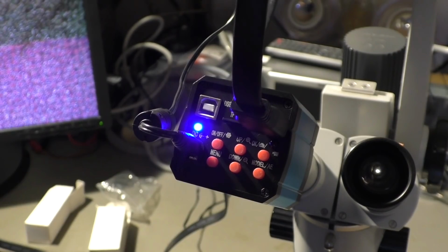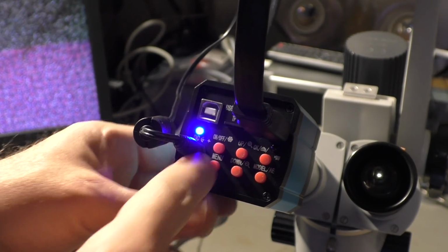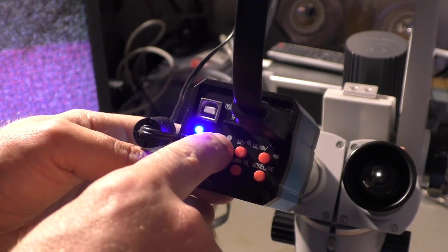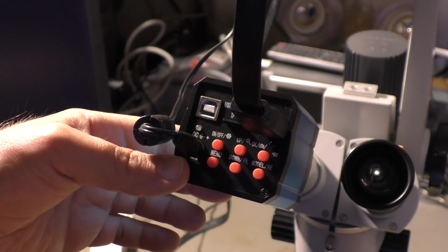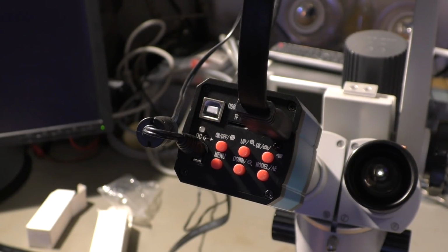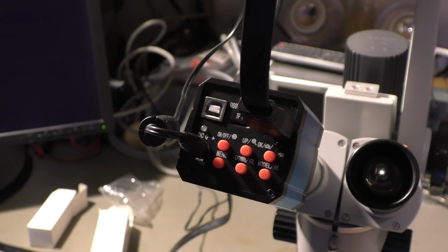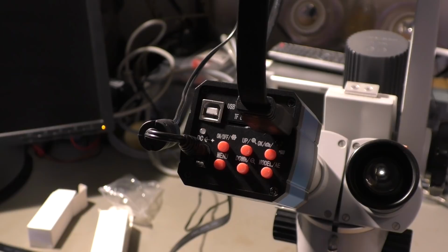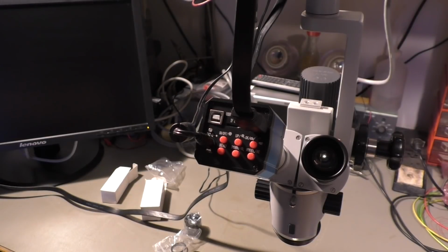Okay. The blue LED is super bright, it's almost blinding you. Turning it off. Remove the card, and now you can put it in your PC and do whatever you want with it. And that's what I will do in the future with this microscope camera. I think you will see that a couple of times, because now I really have HD video from my microscope.